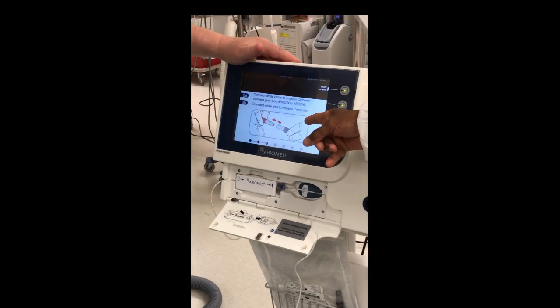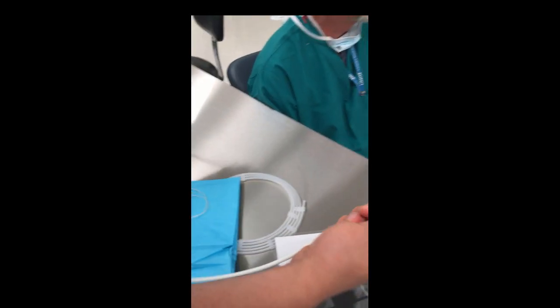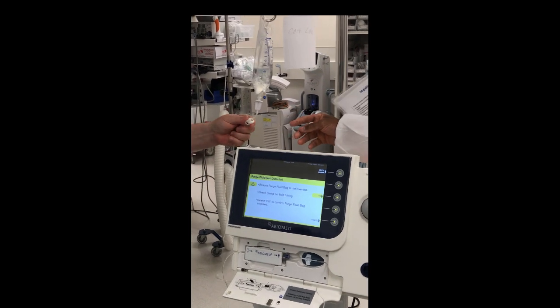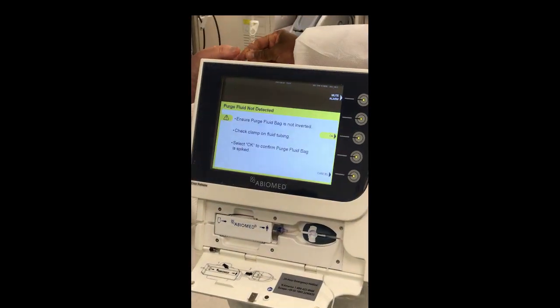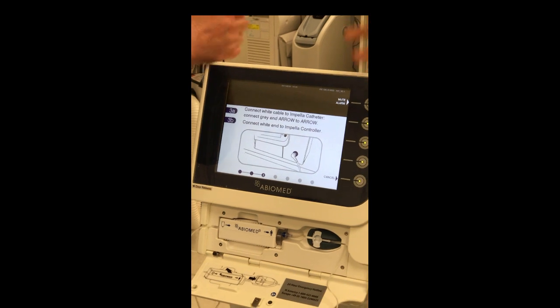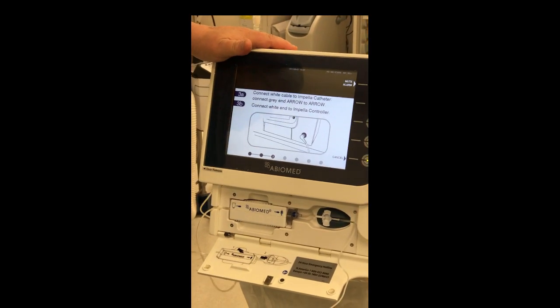Look at what it's asking you to do — connect that cable, as shown in the picture. It then says 'Purge fluid not detected — check clamp on fluid tubing.' There you go — you were clamped. See how user-friendly it is? It's telling us we weren't getting any dextrose because the tubing was clamped. Now that the clamp is released, it should be purging.